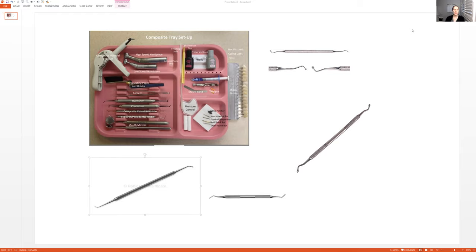So I want to talk to you guys about the composite tray setup. Keep in mind that depending on the office, things might be a little bit different. But if you have all of this on your tray, you're in good shape. And I know it's blurry and hard to see, so that's why I'm going to go through everything with you.